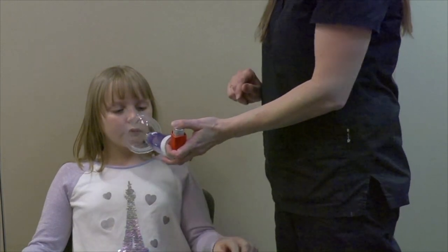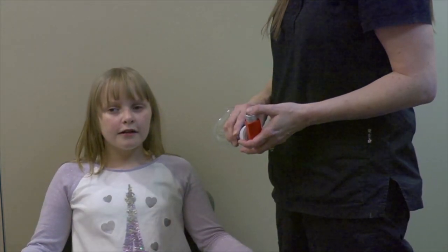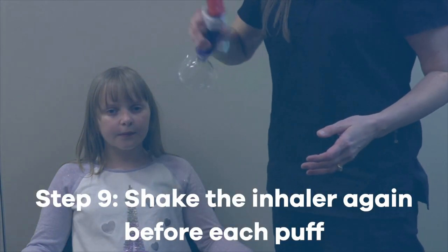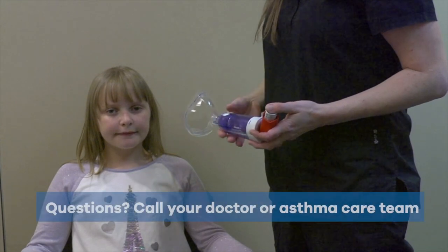Step 8: Take a break that is long enough for your child to catch their breath again. Step 9: Shake the inhaler again before each puff if more than one puff is ordered.